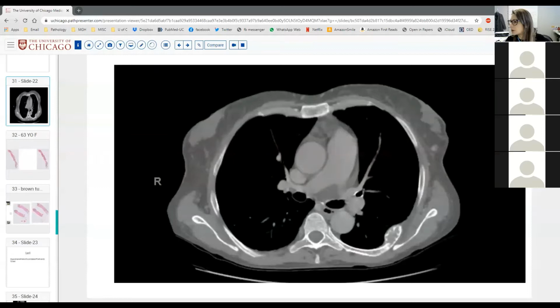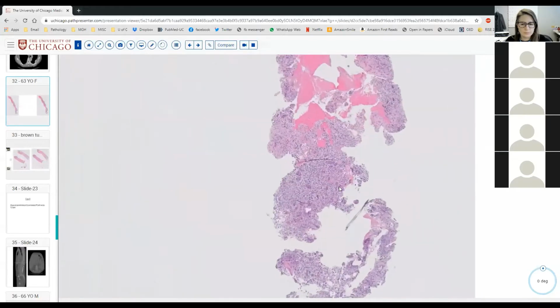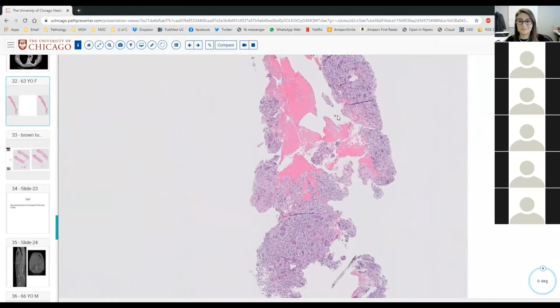Cool. Hold on one second. Let me just pull up my, oops. All right. Okay, so here is the core. I can try. Thank you. I actually just reviewed it like 2 minutes ago.